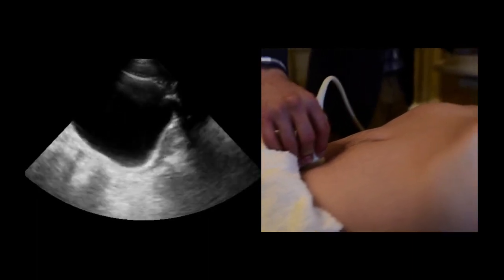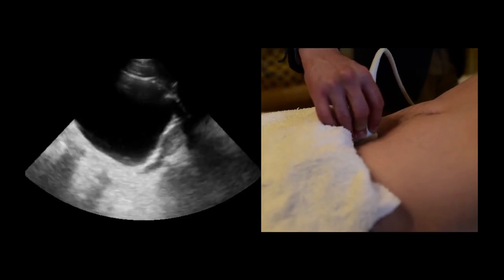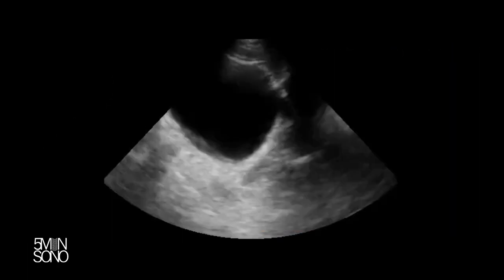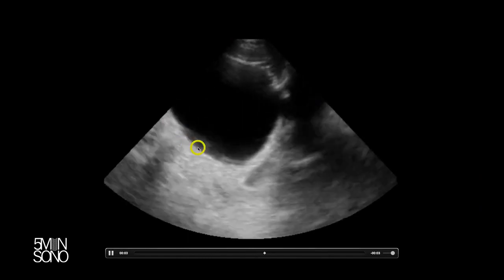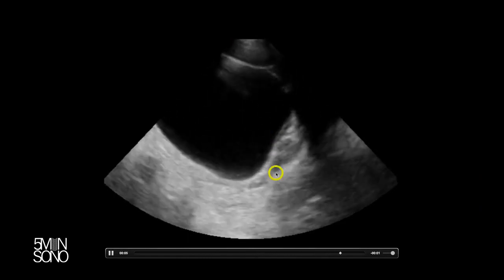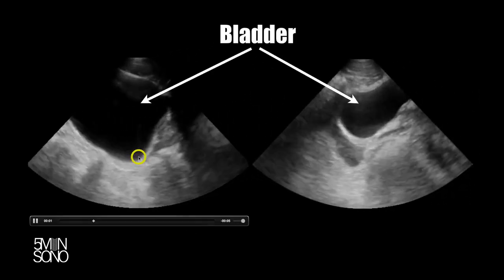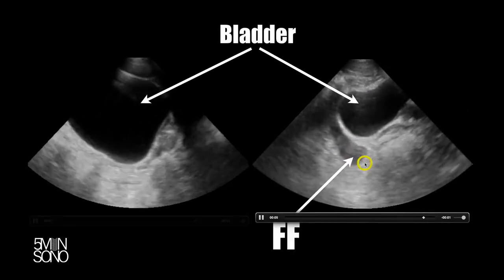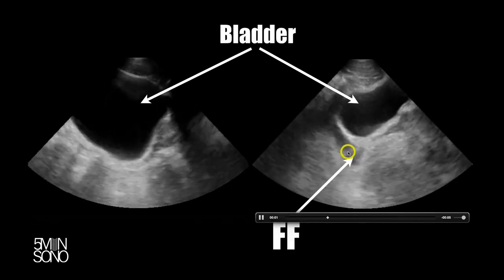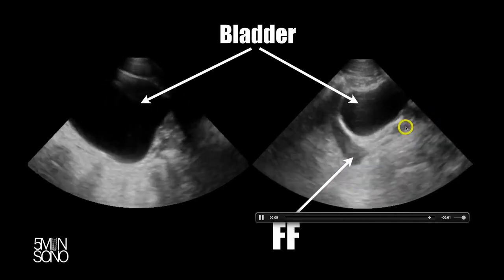The next part of the exam is going to be looking at the pelvis. The probe needs to be placed just superior to the pubic symphysis with the probe marker facing up in the sagittal orientation. This is a male pelvis — this is the bladder. The peritoneum is up here. These are normal physiologic structures: the prostate and the seminal vesicle. The bladder contains normal fluid, and over here we have abnormal free fluid — this is fluid in the peritoneum. It's very important to look for it up here and not down here, because down here there are physiologic structures.